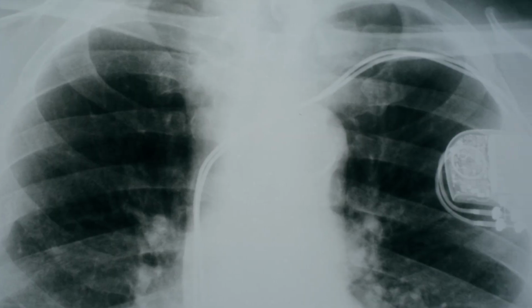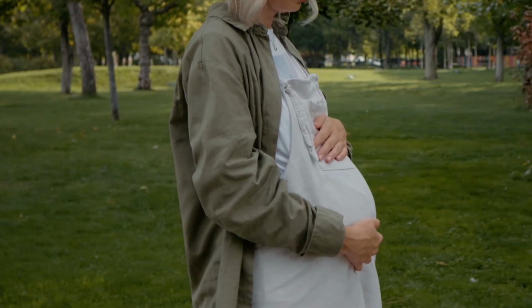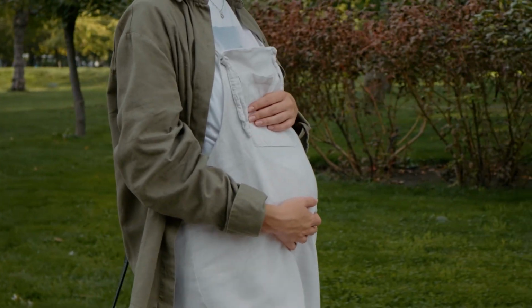Another key difference between the two is the precautions. So with electrical stimulation, a precaution that is very significant is if you have a pacemaker or any kind of electrical unit within the body that might be used for something else. Another common issue is pregnancy and being placed over that specific area, or other reproductive organs is also a precaution associated with electrical stimulation.